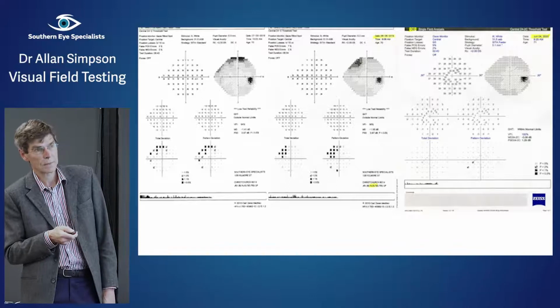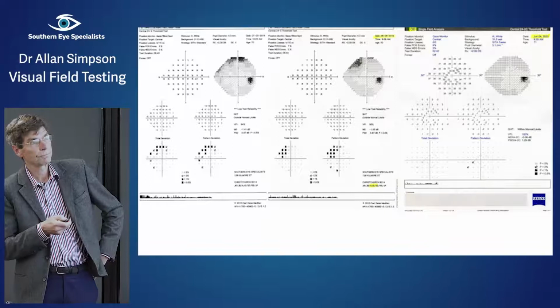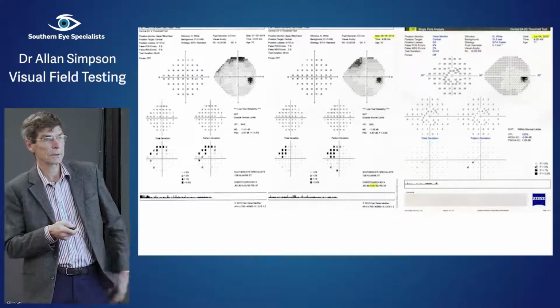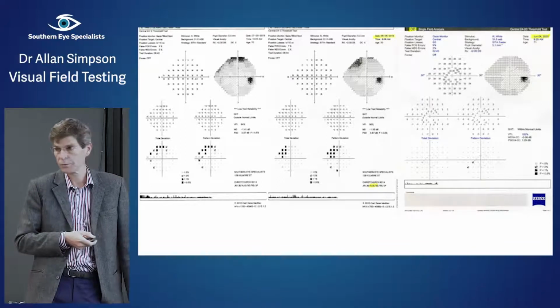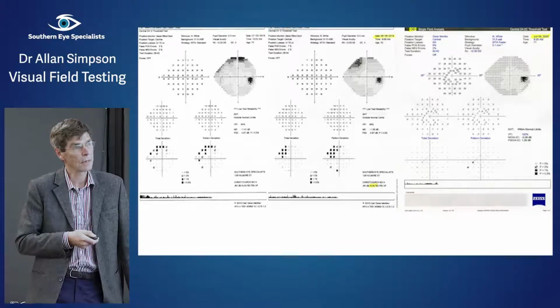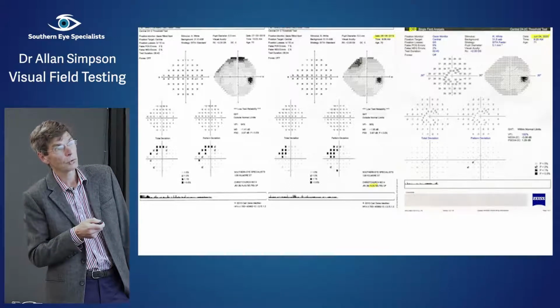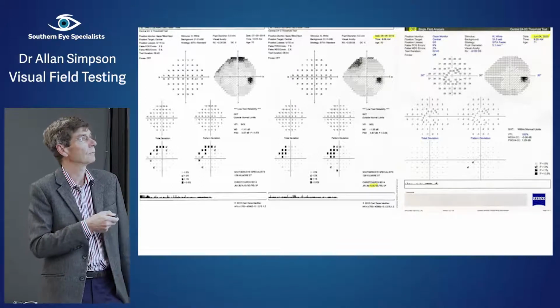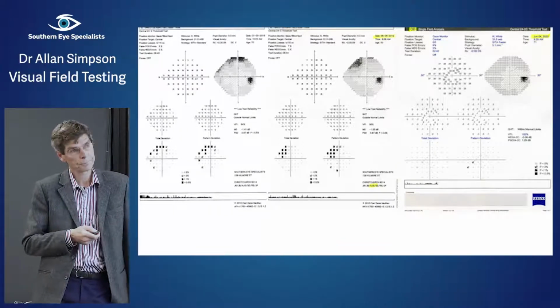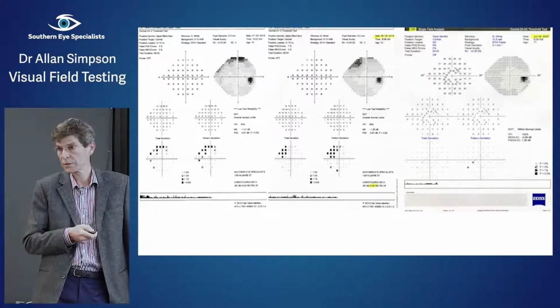24-2C test that doesn't seem to pick it up. And it's a pretty good test. That's possibly a little bit alarming in the sense that there's nothing much showing up here, whereas previous tests were showing something. So that did raise a red flag or two for me that, maybe we're making this very short test, 2 minutes 40 compared to 5 or 6, 5.5 minutes, half the time. That might be good, more reliable perhaps, but are we missing something important?